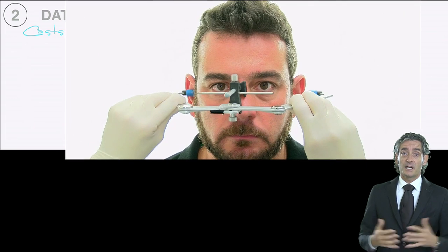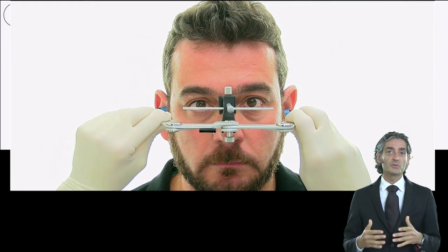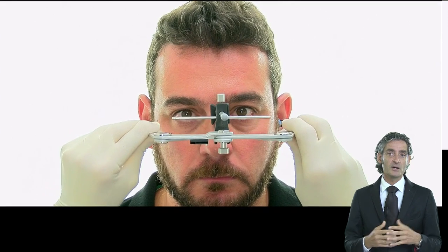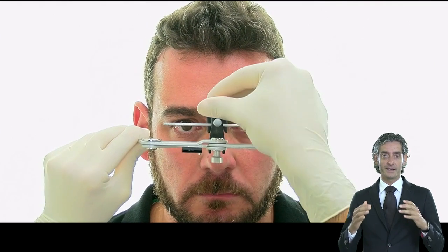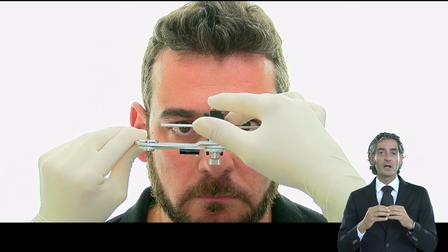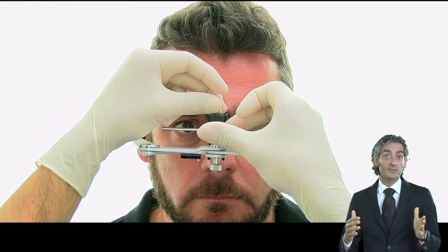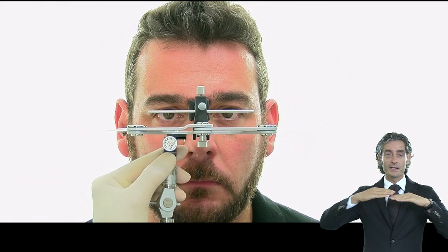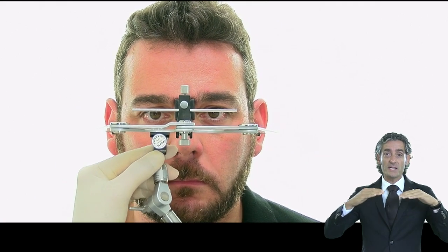Another step is the face bow. Remember that if you give the face bow to the technician, it will be much easier for him to evaluate the position of the upper arch or the horizontal reference, and then start, if you say, for example, that you want to organize the occlusal plane parallel to the horizon of the patient. That can be the bipupillar line, for example, or another horizontal reference.